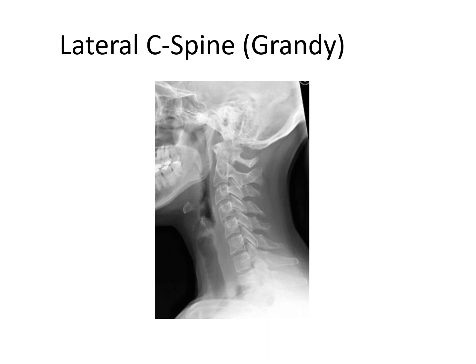Now, but that's not the area. The soft tissue really isn't the area of interest. The area of interest is the vertebral bodies of the cervical spine. And so we want to be able to figure out if we got them all. At the top, right under the base of the skull, that first one is C1. And then the one that's bigger than it immediately underneath is C2, and then 3, and then 4, 5, 6.